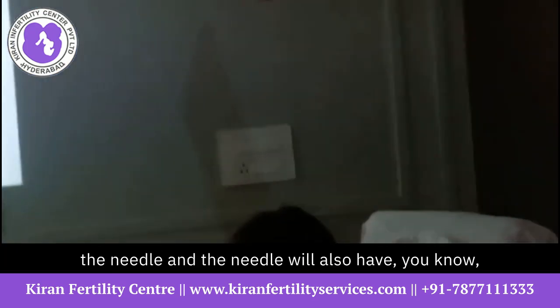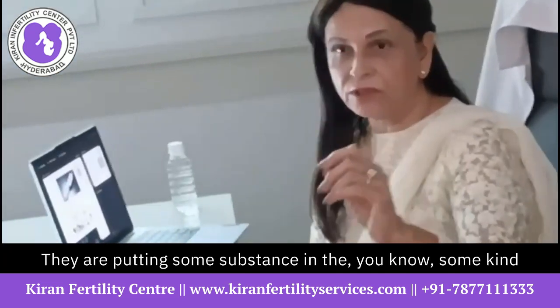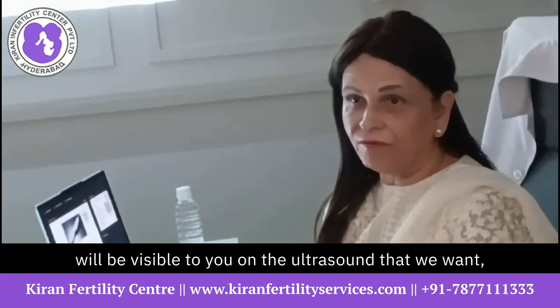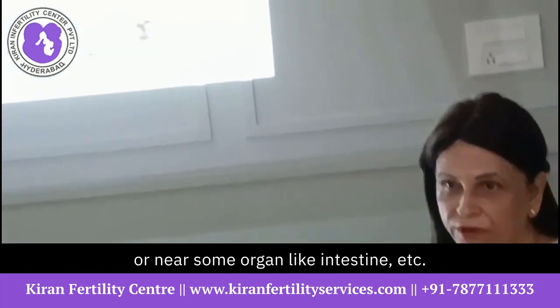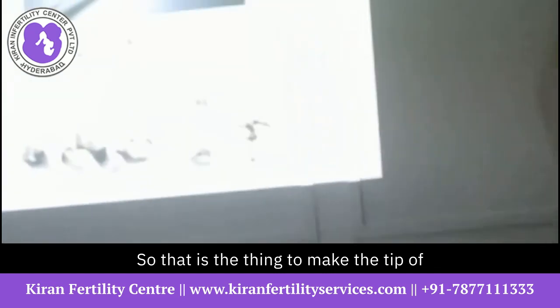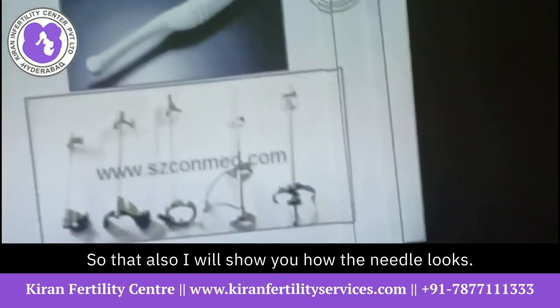And the needle will also have what is called an echo-dense tip. They put some kind of metallic substance in the tip of the needle, which will be visible to you on the ultrasound. That we want, because we should not go near a vessel or near some organ like intestine, bladder, rectum, without knowing. So that is the reason to make the tip of the needle echo-dense, or visible in the ultrasound. That also I will show you, how the needle looks.